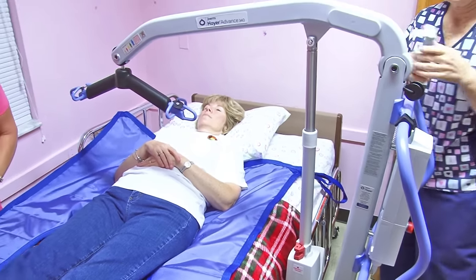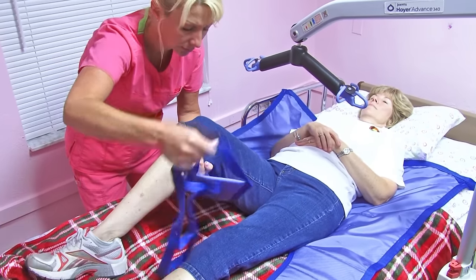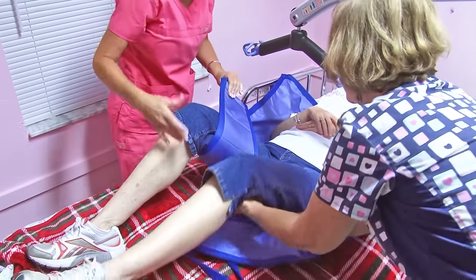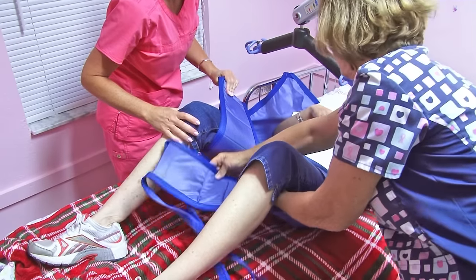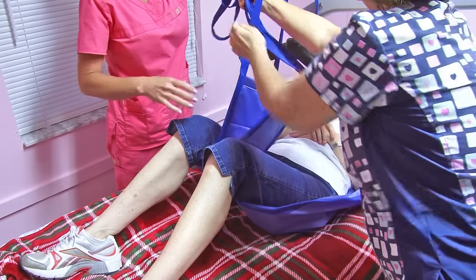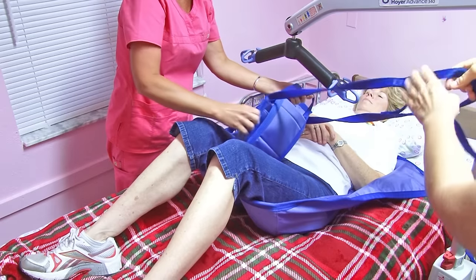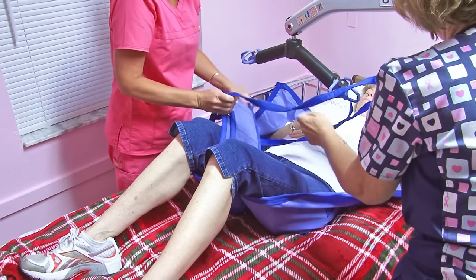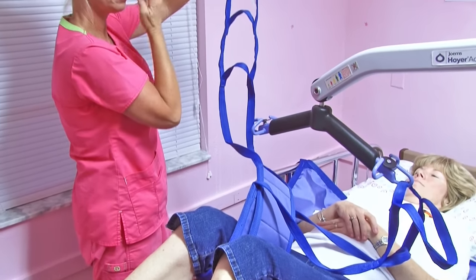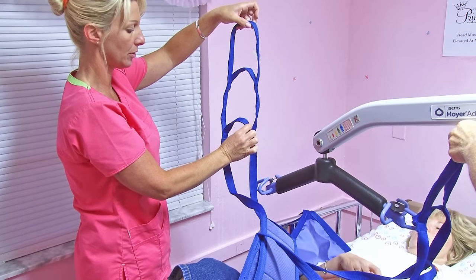You're going to wrap the leg straps around the back of the thigh. Lift the leg, and then go through so each person has a crisscross. There are three loops — one, two, three — that will eventually be color-coded so you'll know which color for each specific resident.